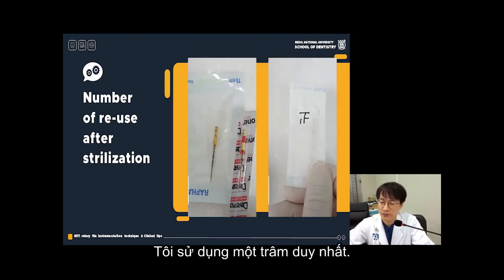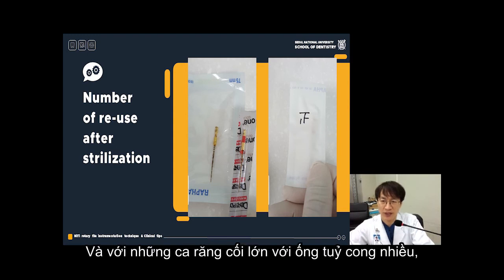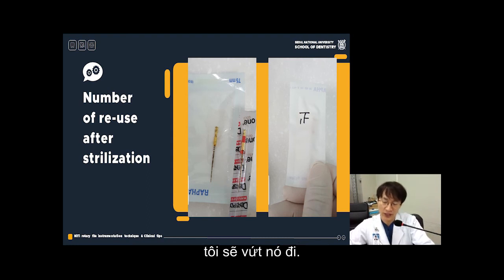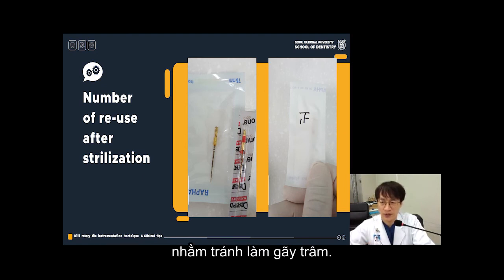So I use one single file, like in Chinese character, and how many times you use. And then if it is based on molar case with a severe curvature, then I throw it away. So it kind of prevent by yourself. You make it rule so that you can prevent the separation of the file.